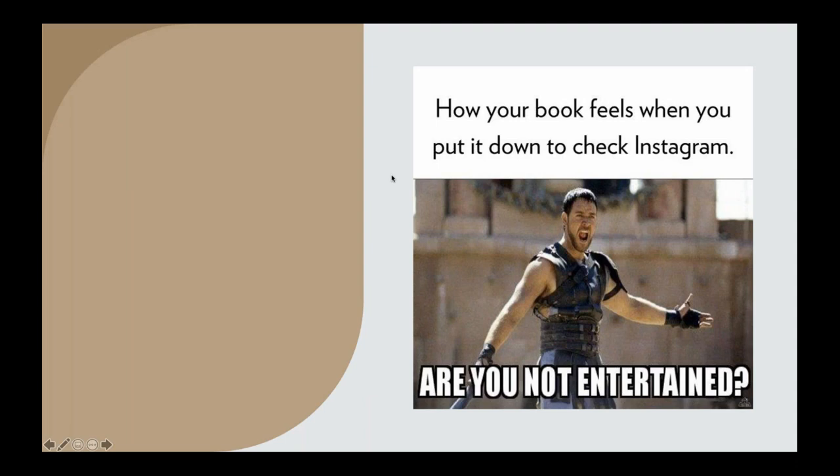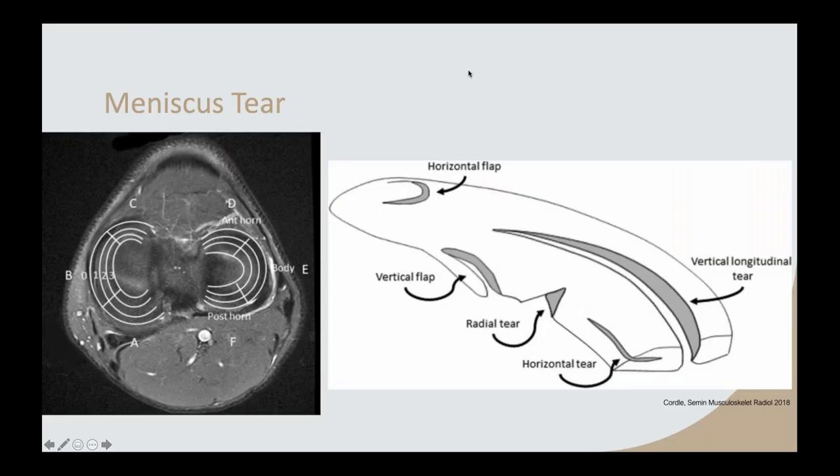All right, so we are good on timing. We're halfway there. We're going to move down south to the knee now, which is actually more familiar territory to everybody. Definitely for myself as well, because you know that meniscal tears and arthroscopic meniscal repairs are so common, and it's a very major industry. So you will probably see these cases here and there again and again.